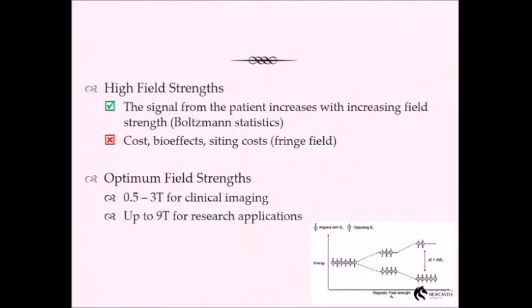There are a few times when you may not, sometimes in pregnancy, because we do fetal MR, sometimes in people that have difficulty regulating their temperature. So there may be people that have had a stroke and they have trouble controlling their temperature. You don't want to go to first level, because at the end of the day you're transmitting radio frequencies which will heat them up. Second level, you cannot go to second level unless you've got a full research license and the people that you're scanning have been informed by consent that that's what you're going to do to them.